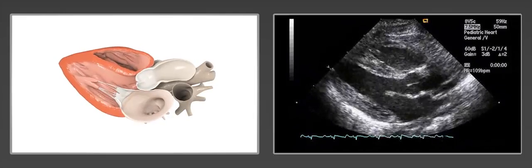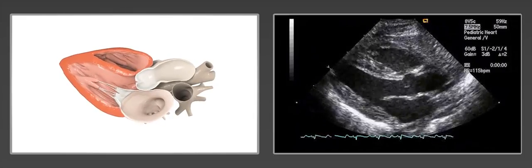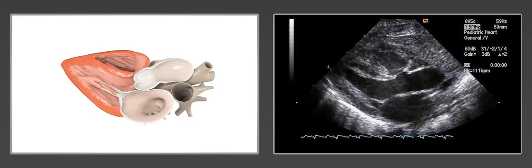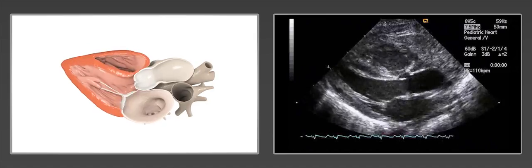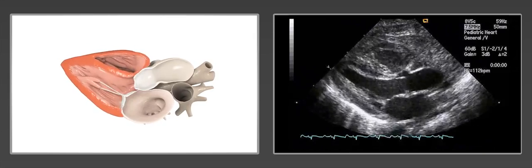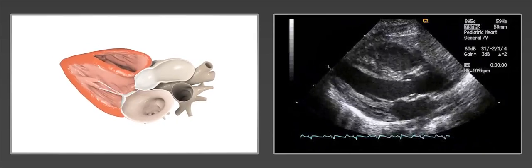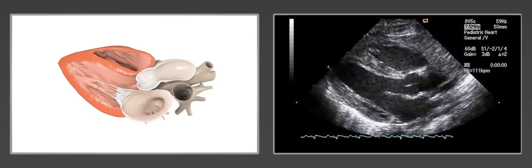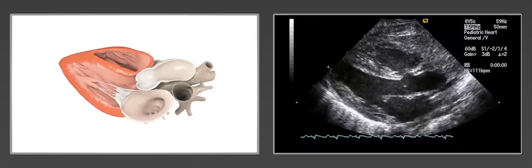This view shows cardiac structures, chamber dimensions, the mitral and aortic valves, ventricular function, and left ventricular wall thickness.